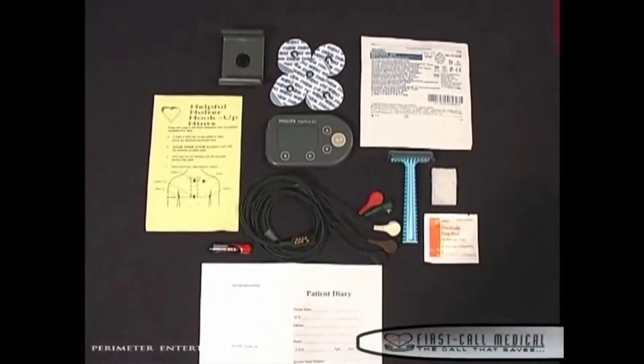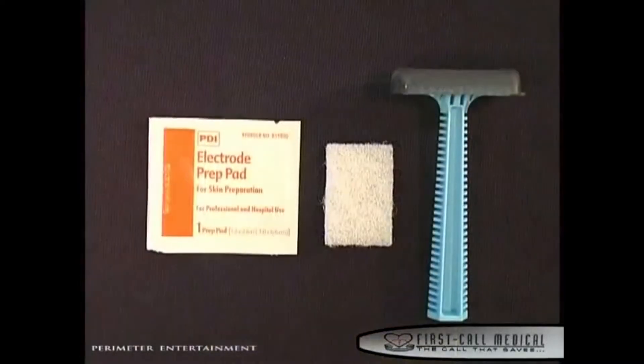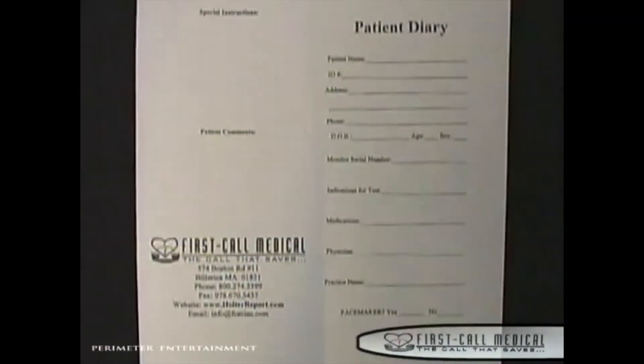Inside the holter kit, you will find a holter hookup diagram, razor if needed, alcohol prep pads, scrubby, two packs of electrodes, one AAA battery, and a patient diary.